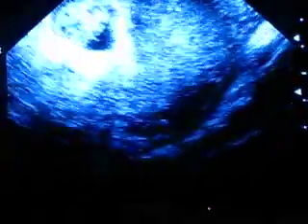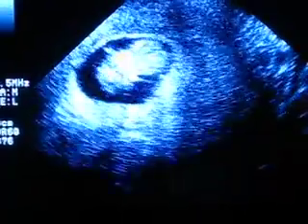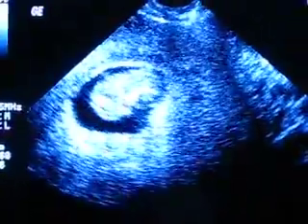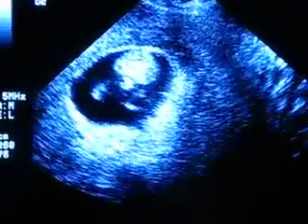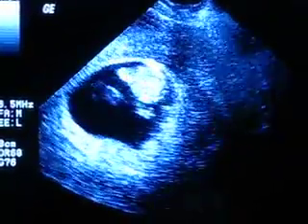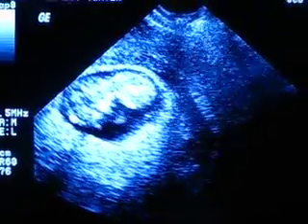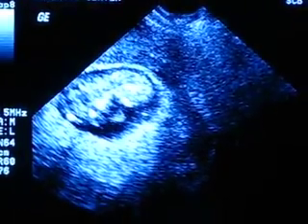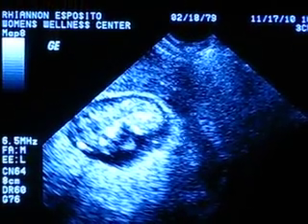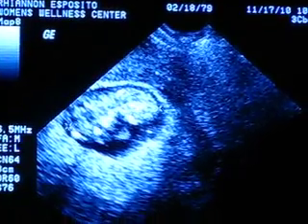Look at this one, moving and shaking — cute, all over the place. I'm waiting for this baby to get in the right position so that I can measure the crown to rump. I wonder if that's about the best I'm gonna get. Let's try it — tip of head.